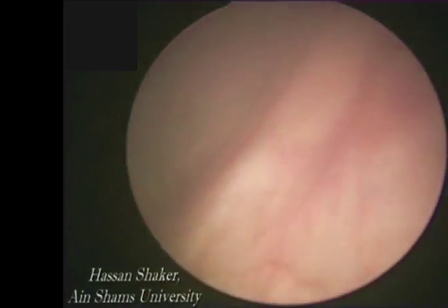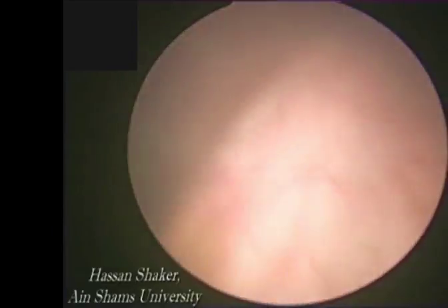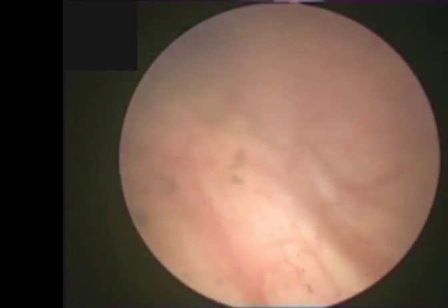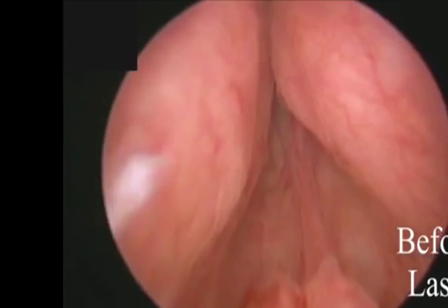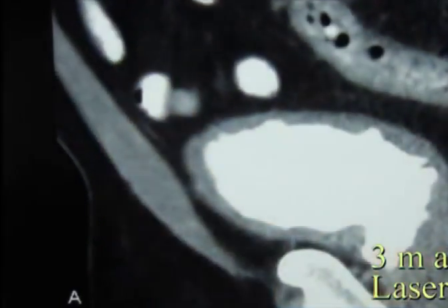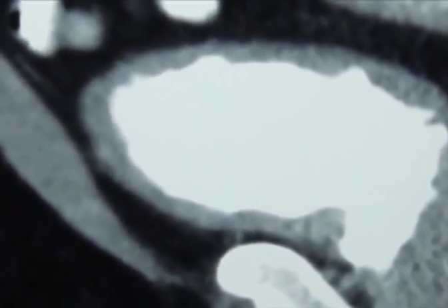The Q-LAP is a fast, bloodless procedure that is easy to master and provides good results with minimal complications. Complete healing of the prostate is seen in this image in a 3-month follow-up cystoscopy of another patient having a concomitant TCC of the urinary bladder. CT with contrast for the same patient shows a widely patent prostatic urethra after 3 months of the Q-LAP.